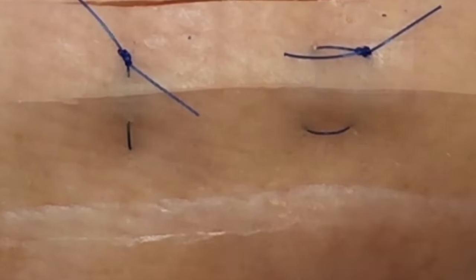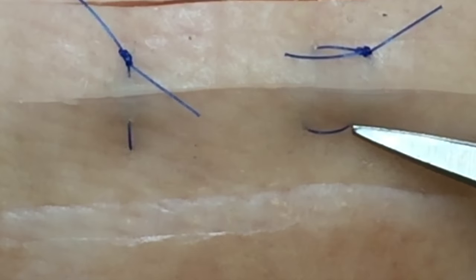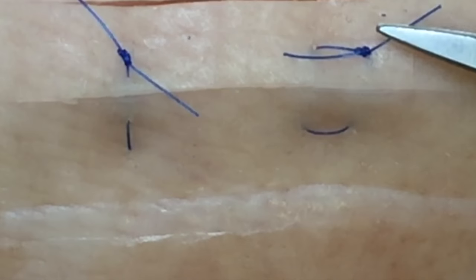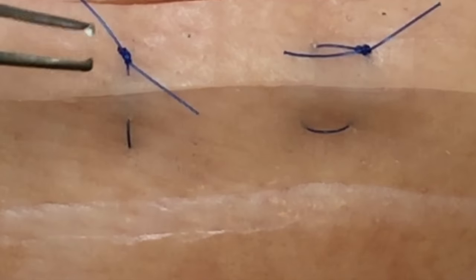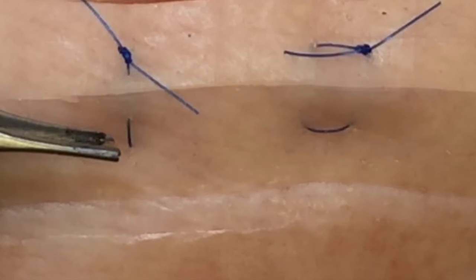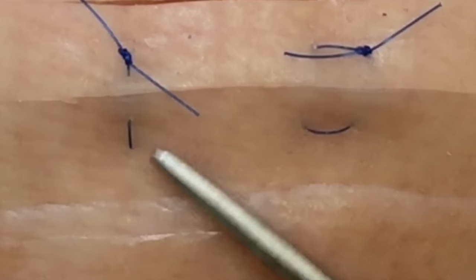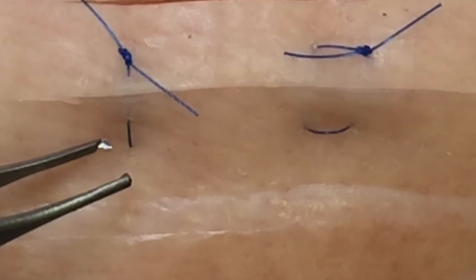The important thing to remember is that this part of the suture that has been sitting on top of the patient's skin for a couple of weeks is colonized and should not be dragged back through the wound that is clean. To remove the suture, begin by identifying this part. If there is a lot of crusting, clean the area with some saline to expose the suture and make it easier to lift.